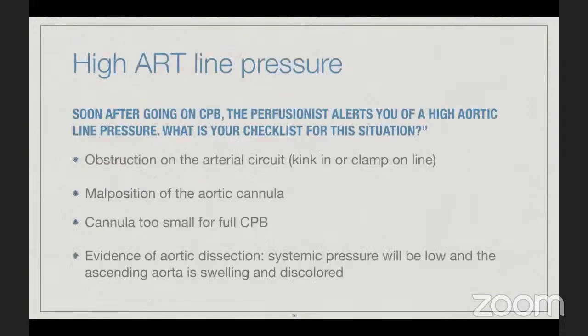So now, soon after going on bypass, the perfusionist alerts you that there is a high aortic line pressure. What is your checklist for this situation?